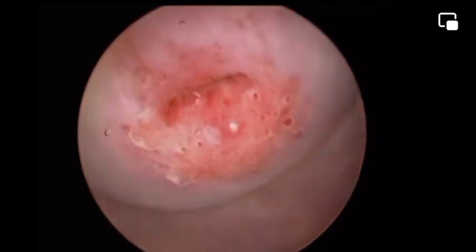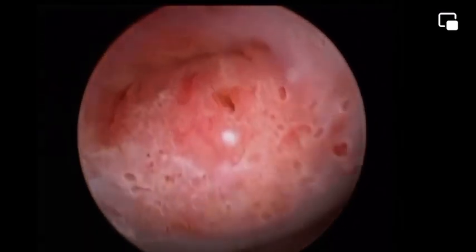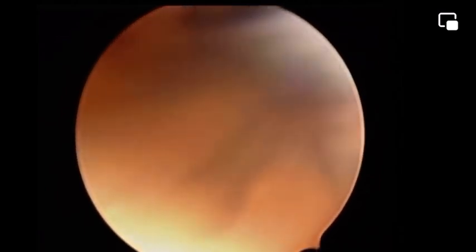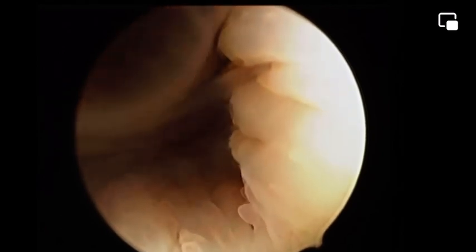In this case, we will share together two different types of hysteroscopic pathology. The patient had a previous history of a cesarean section, followed by intrauterine adhesions and secondary infertility. So when we go through the cervical canal, we face this very viscid, thick, cloudy mucus, which is mixed with blood, and this is a characteristic of cesarean scar niche, or the famous name ismocele.